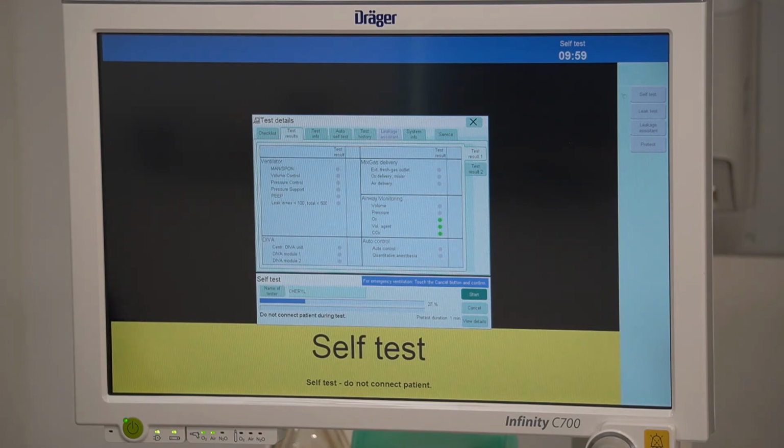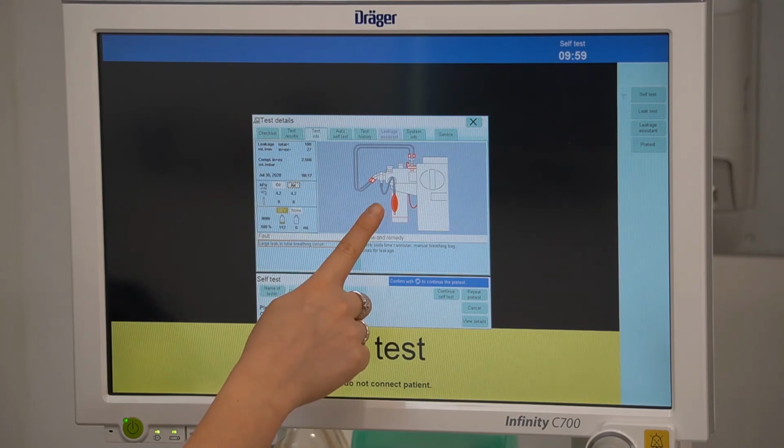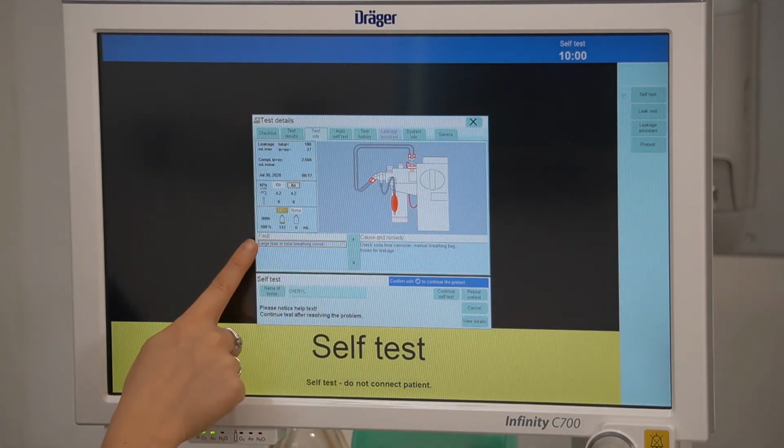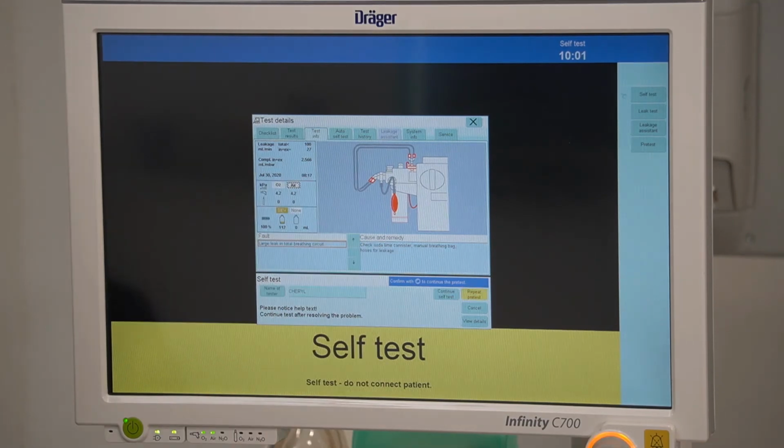Now to check the suction Y-piece checklist. Please verify your endotracheal suction is functioning as per usual practice. Microbial filters apply to users with device and filters connected to the inspiratory and expiratory port of the breathing system.